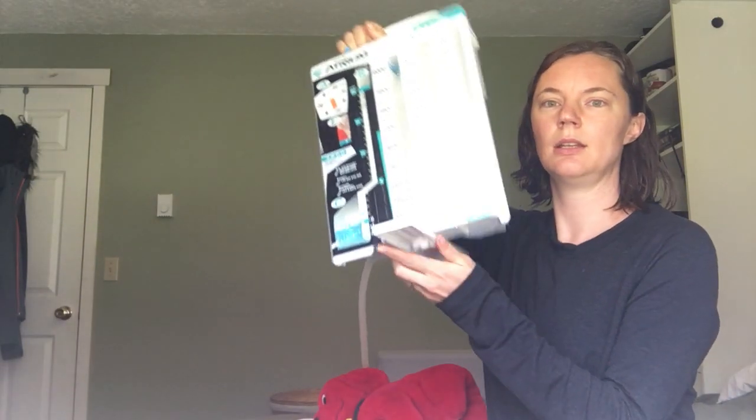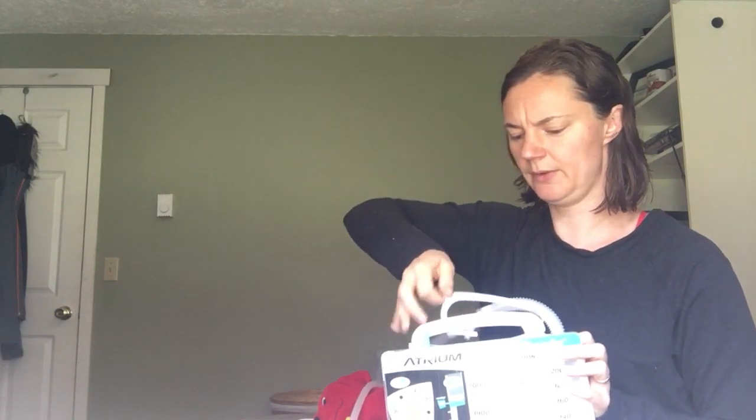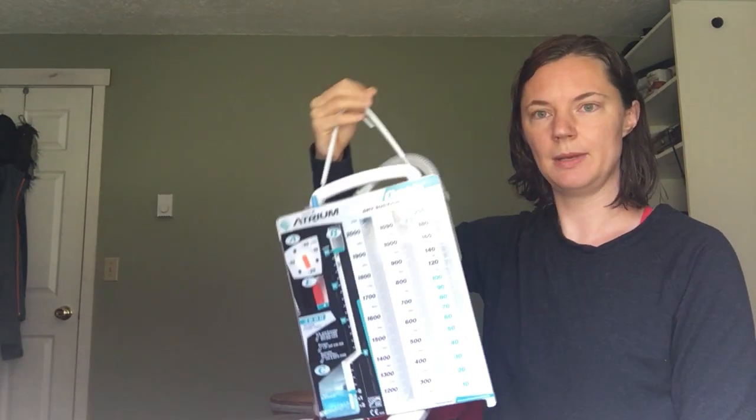It has a little thing on it that you can turn and have it sit so it doesn't tip. It has little hooks on it that you can use to hang it at the foot of the bed. So we usually use both the hooks and the stand to try to keep it from tipping. You don't want it to tip. But do walk your patients.